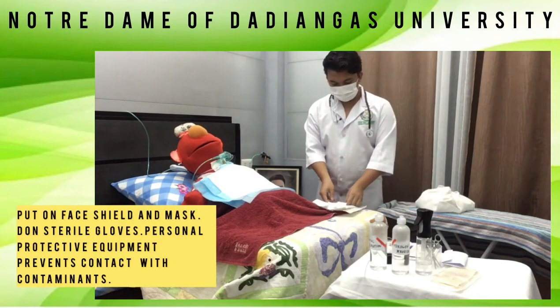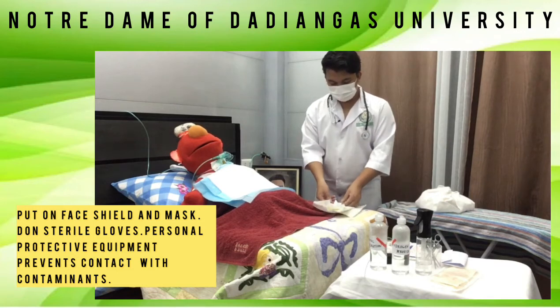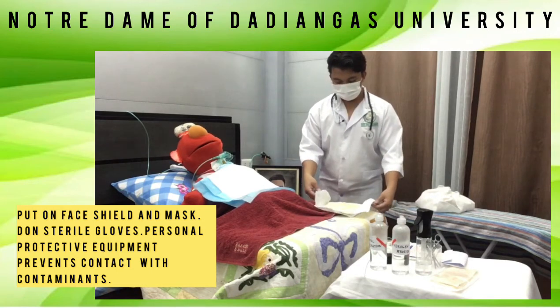Put on face shield and mask. Don sterile gloves. Personal protective equipment prevents contact with contaminants.